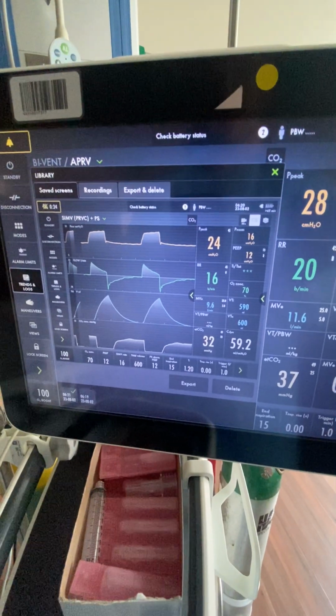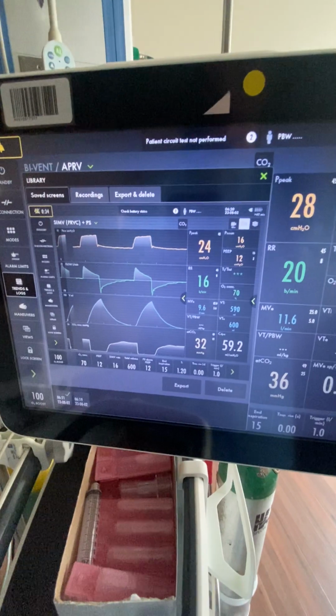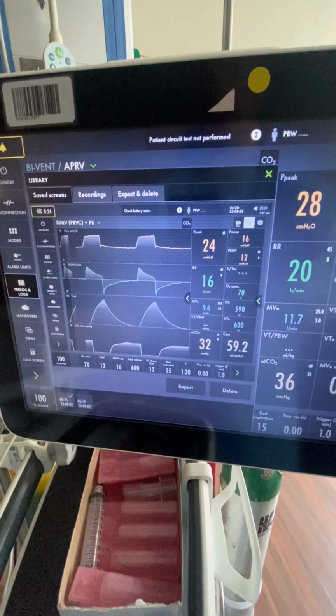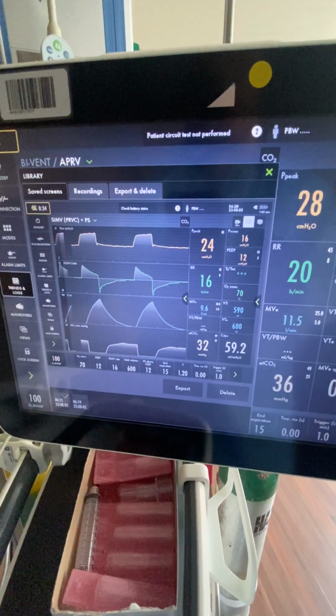Airway resistance is often induced by large amounts of flow. It can also be the tube size, secretions occluding your airway. If you rule those things out, you need to look at your flow and how fast it comes in. But this was all a self-induced matter.